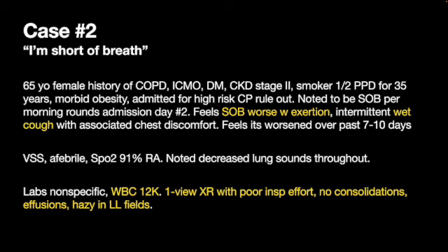Again, your one view chest x-ray just isn't very good. Maybe there's some haziness in the bilateral lower lung fields. So while you're talking to her, performing your H&P, you let her know I'm going to be doing a point of care ultrasound to take a look at your lungs. And she is very excited and interested in your skill set.